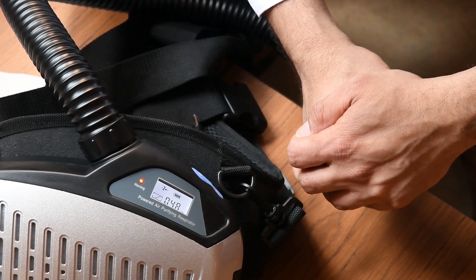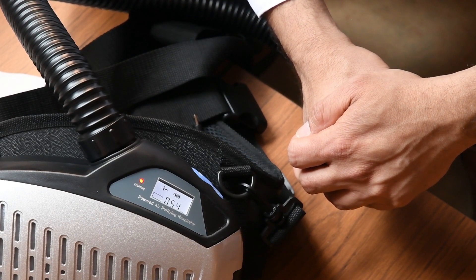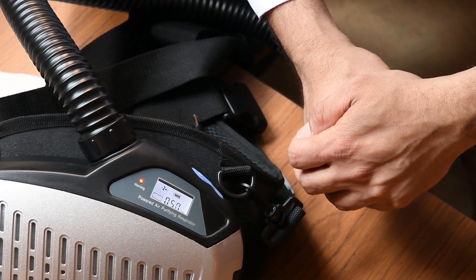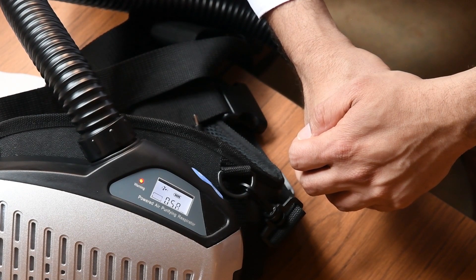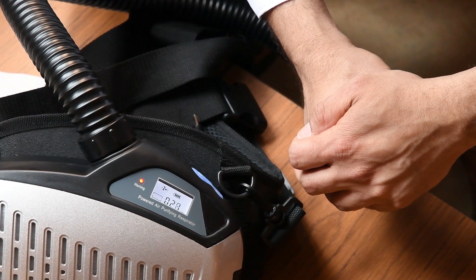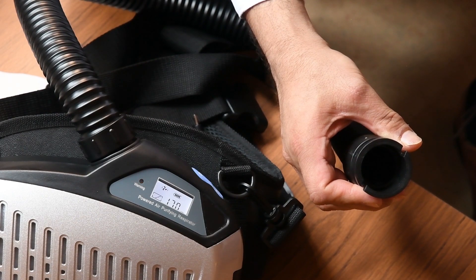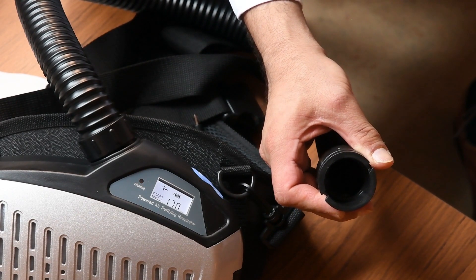It can take up to 15 seconds. You can see the alarm light is flashing and the HEPA filter icon is also flashing, which shows that the alarm is working well. And now it's back to normal functional mode.